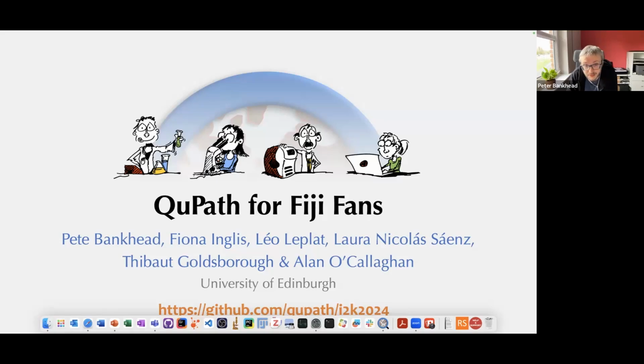So I'm Pete Bankhead. If you know me, you know that I'm involved in QuPath, well, created QuPath, but also a big fan of Fiji and ImageJ and used them for a long time before. And so, even though I'm very much in the world of QuPath at the moment, I still use ImageJ and Fiji all of the time.